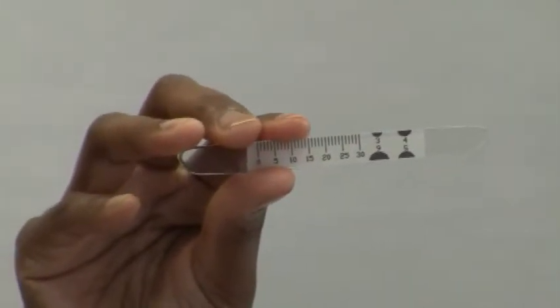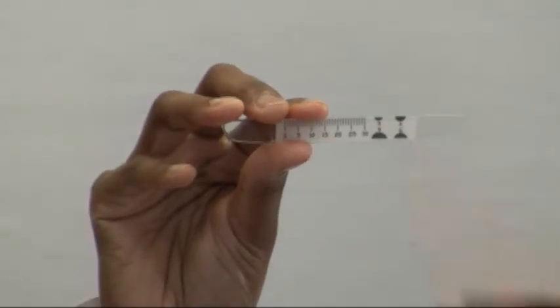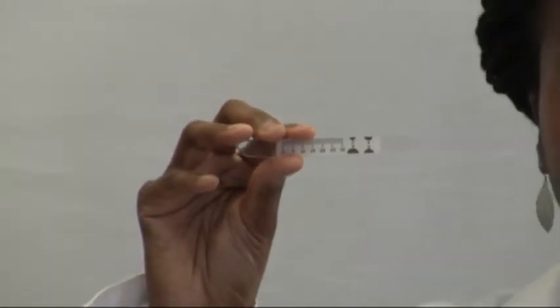It can also be used to measure the pupil size, with measurements of 3, 4, 5, and 6 millimeters conveniently located on the plate.